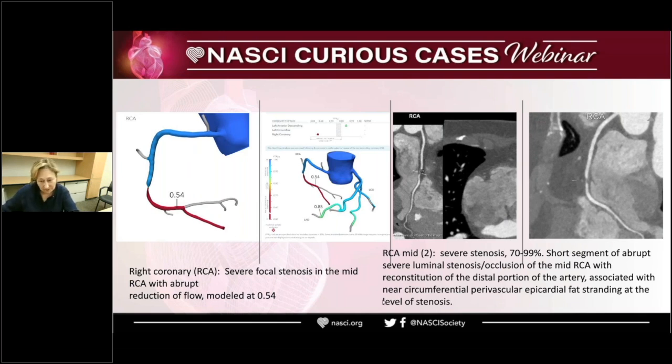Nice, nice case, Luba. This is Shaima. This patient does not look like having any calcifications or calcified plaques. Is that correct? Yeah, absolutely. And that was the reason. When I read that case, I said, you know what, I really worry about SCAD in that particular case, because no atherosclerotic disease, tortuous coronary arteries, no calcium, female, middle-aged female, and then, you know, we should think about SCAD as well, but it turned out not to be.